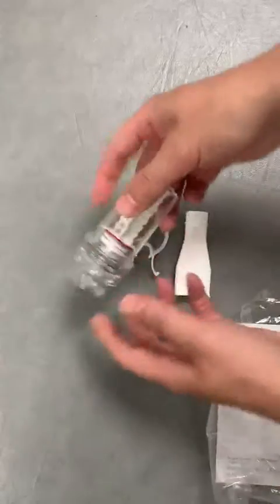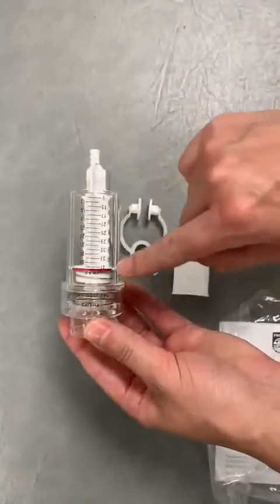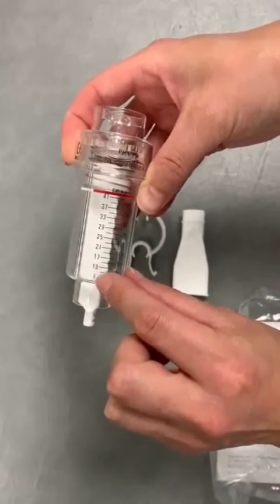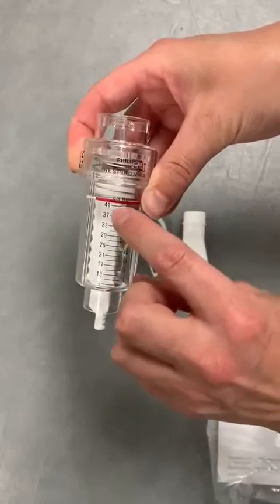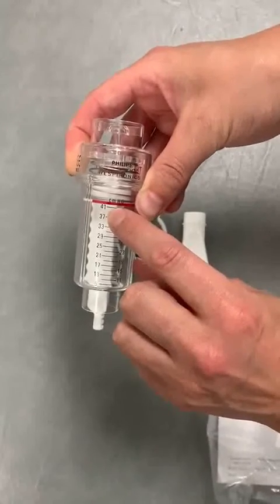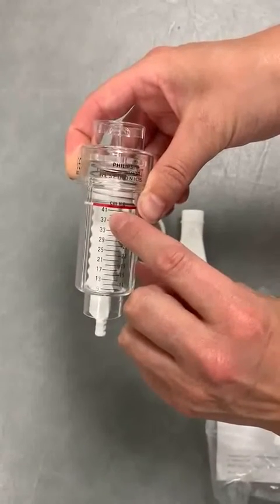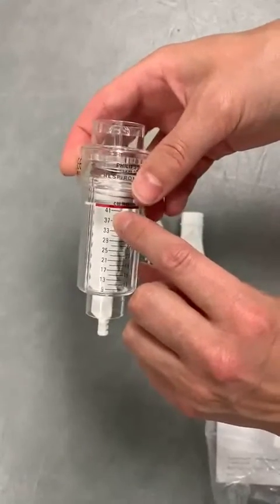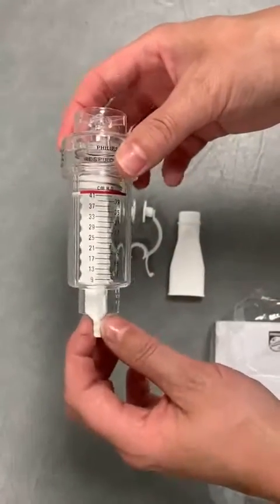To adjust the threshold device, you can hopefully see the numbers down the side here. This device goes from 9 cm of water to 41 cm of water. You would calculate the setting based on the patient's sniff nasal inspiratory pressure, which you would have done before you started to try to train them.